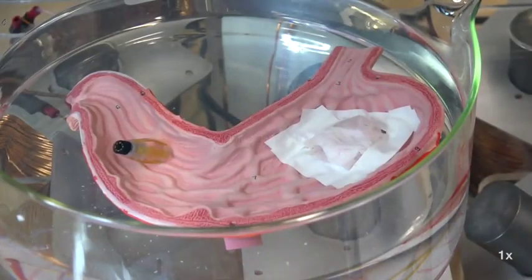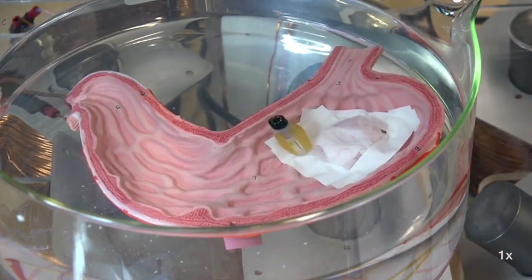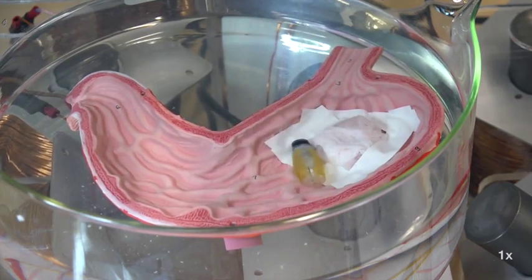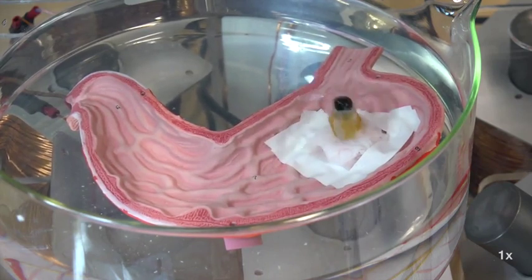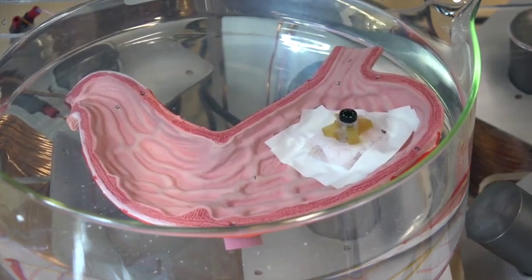We have demonstrated the robot's biopsy functionality with a biological tissue sample on a plastic stomach model in water. Precisely controlled rolling locomotion leads the robot to the sample. Once the robot reaches the sample tissue, it performs a repetitive collapsing motion, jabbing the fine needle inside the tissue.